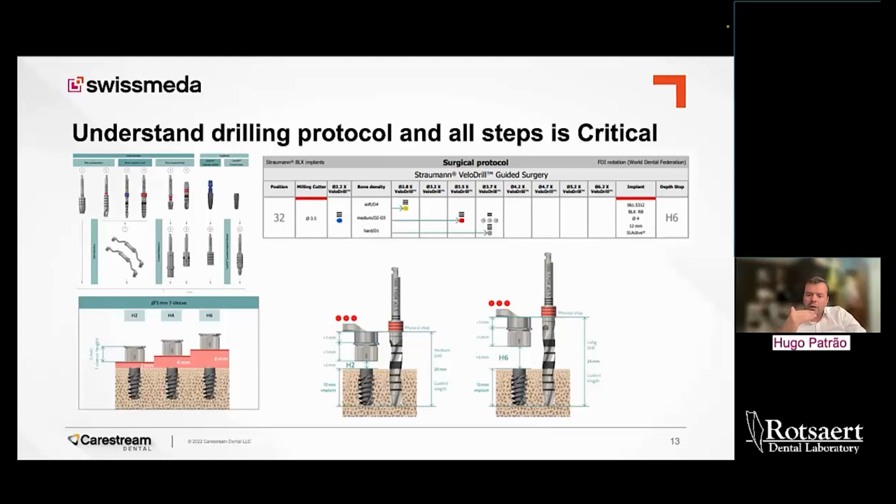You might need to have a little bit of a learning curve, but as soon as you become familiar with that, then it's a walk in the park because it automatically comes to you. But take your time if you do guided surgery to learn about guided kits. This is just a typical example that you have here.